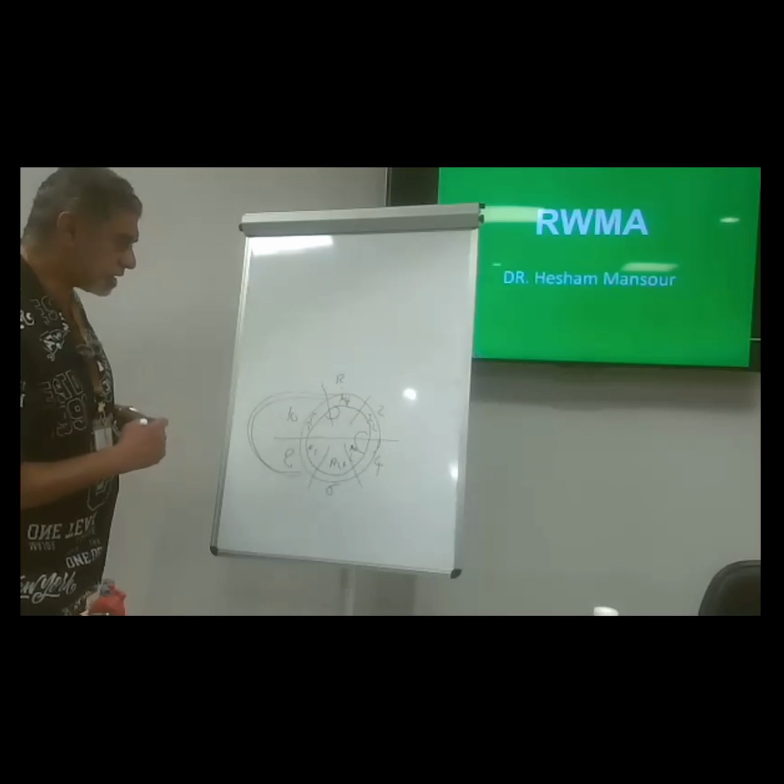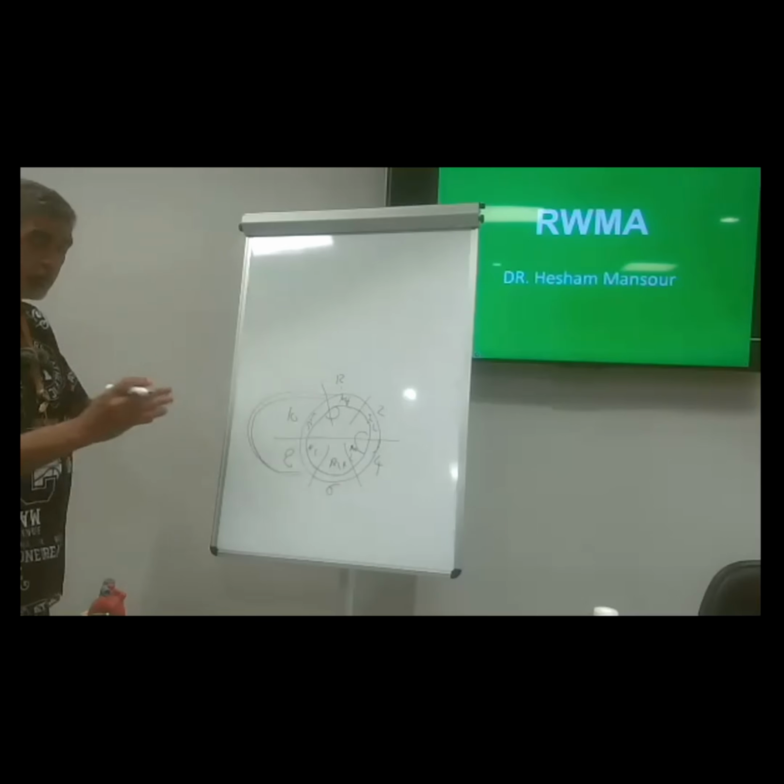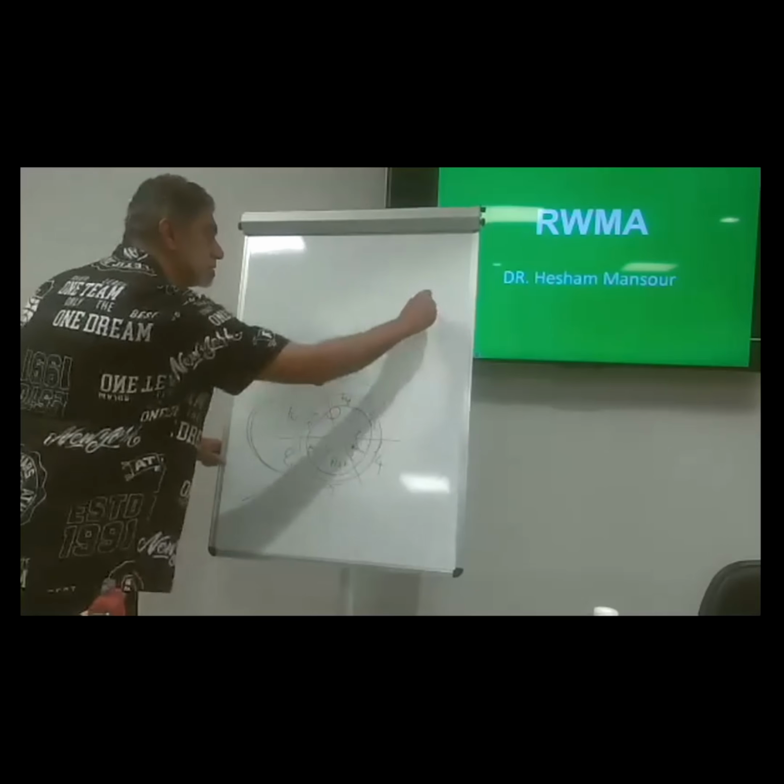Now I will make another thing. I will make the beam of the TE go like this.